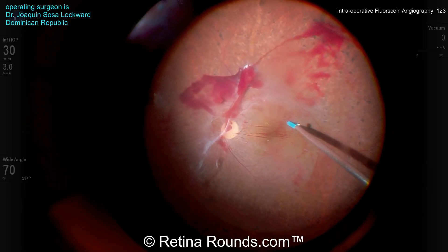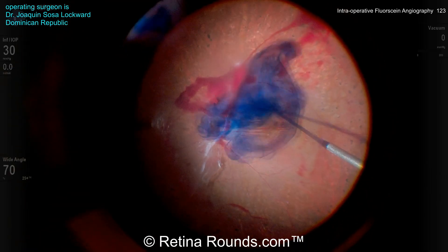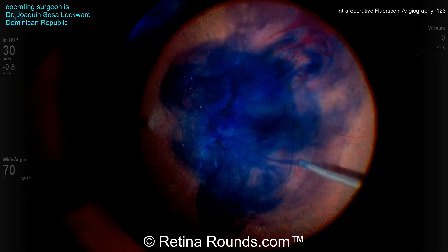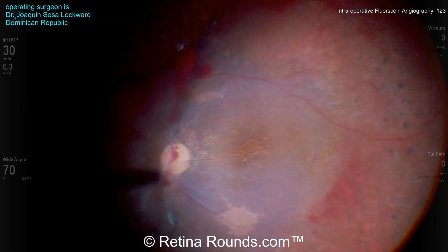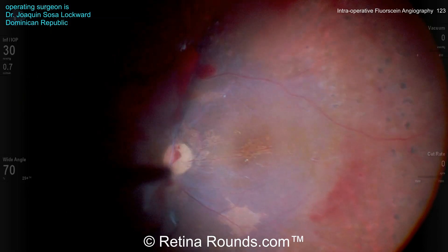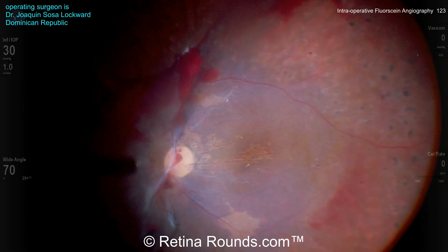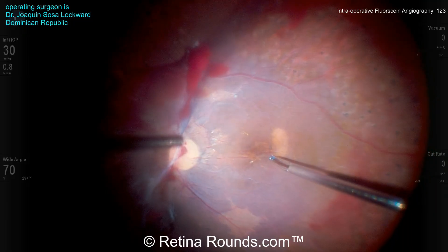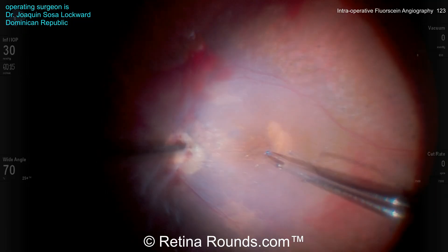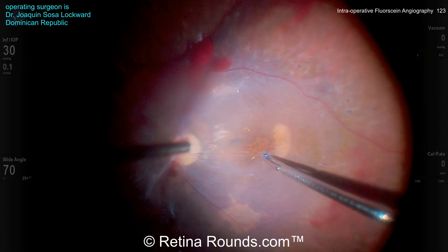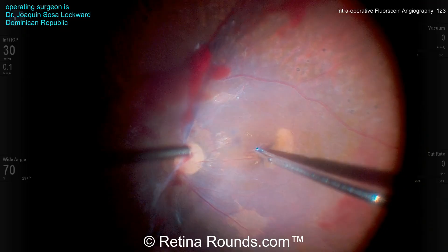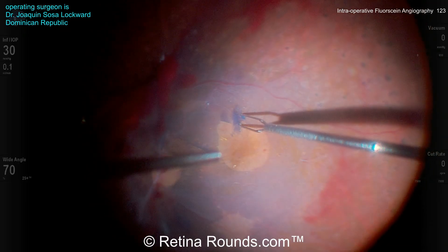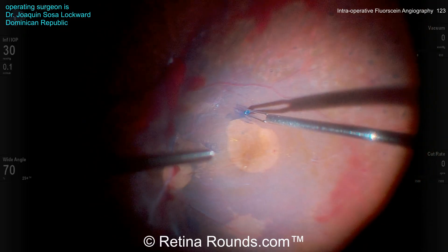Now he's clearing off some of the pre-retinal hemorrhage, and it looks like there is some striae in the macula, so there may be a very fine membrane there. He's gone ahead and stained the macula with tissue blue dye, and using ILM forceps, he's peeling the ILM and stripping that epiretinal membrane from the macular surface.